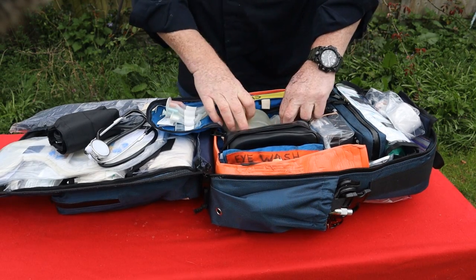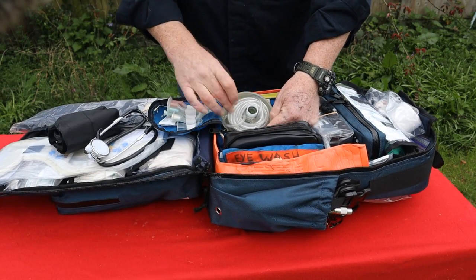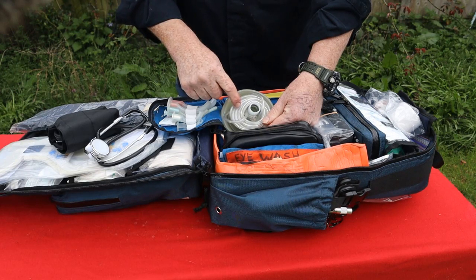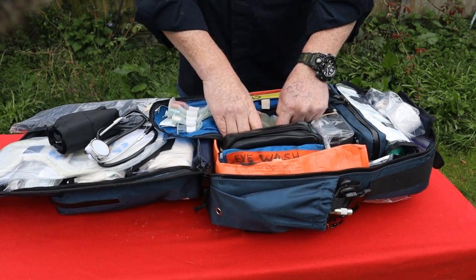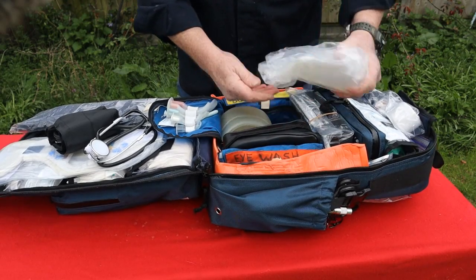So these are all diagnostic bits and pieces. Got a big bag valve mask, positive pressure ventilations with a piece of tube on there. Sometimes you'll find patients have their own oxygen. That's why that's on there.